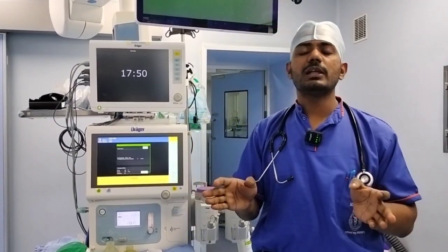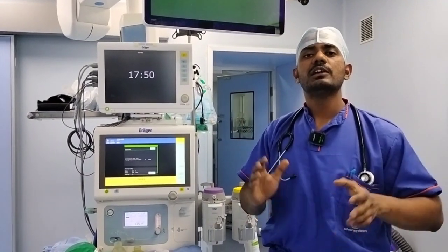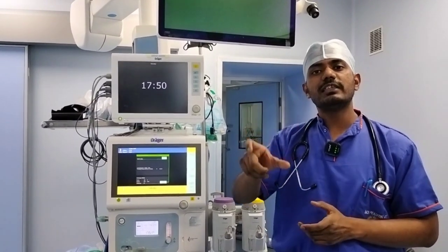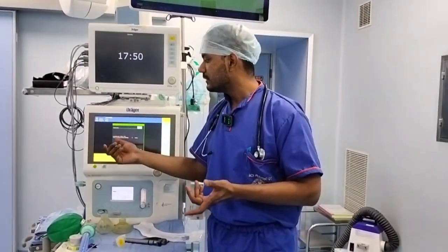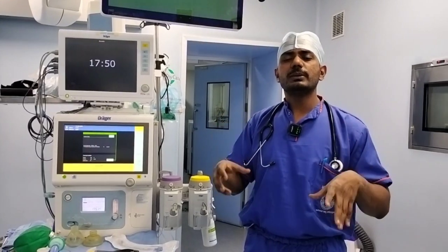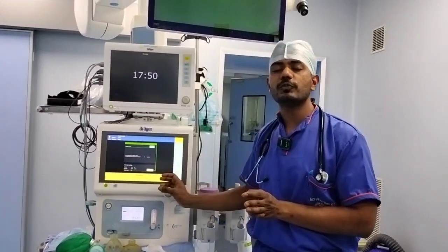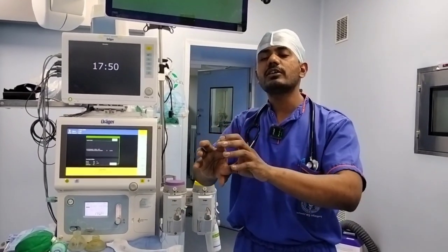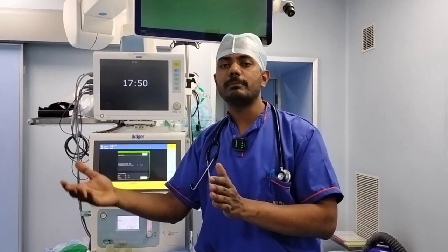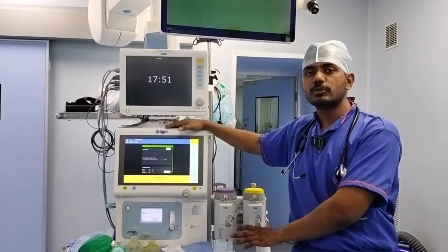In a similar way, when 100% of your lungs is working with 21% oxygen in the atmosphere, you are able to maintain saturation. If 50% of your lungs is not working, with the same amount of oxygen in the atmosphere you won't be able to maintain the saturation. That's why we have the option to increase the amount of oxygen. Also, when you are tired, like COVID patients, who breathe very fast like this, they become tired so quickly. So we take over a few functions of the lungs. But this doesn't replace the complete function of the lung. It gives the lungs time to recover. If you give adequate time, the 50% of lungs which has been damaged will automatically start recovering. That's why we support its function with a ventilator.